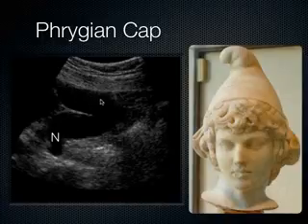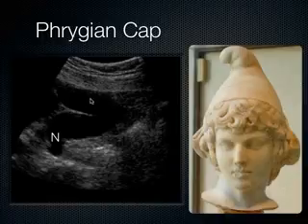And so sometimes you follow these gallbladders throughout all their folds. Just keep in mind that the concept of a gallbladder that's septated is almost impossible. In fact, I've never even seen one. People call me and say, hey, we have a septated gallbladder. I go in there, and if I can just fan through enough, I'll find where it's confluent with the rest of itself, because it's just a fold.